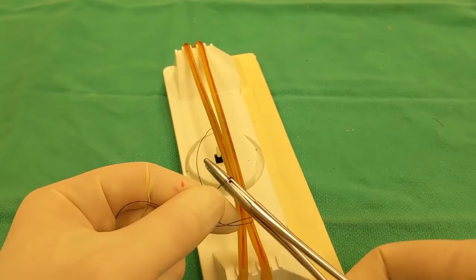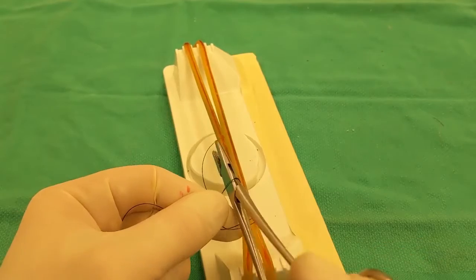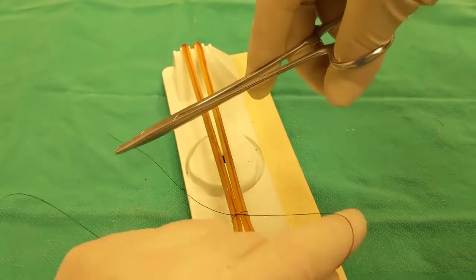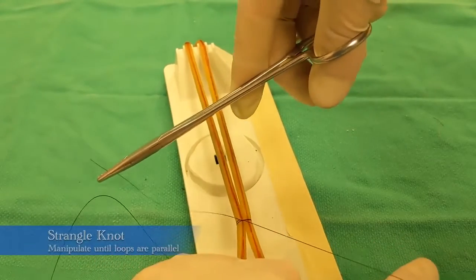The instrument is passed through both loops, so under and through both strands in loops there, and then it is pulled back through and tightened in place, which is when the strangle knot is formed.